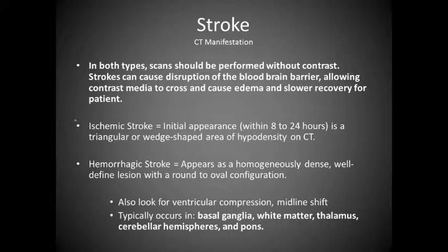The other 2 times they were hemorrhagic strokes, and the doctor or the radiologist advised just to end the study there and to be done with that because there was no need for contrast. And you'll hear a lot of radiologists kind of be a little different on what strokes and contrast will do for each other.